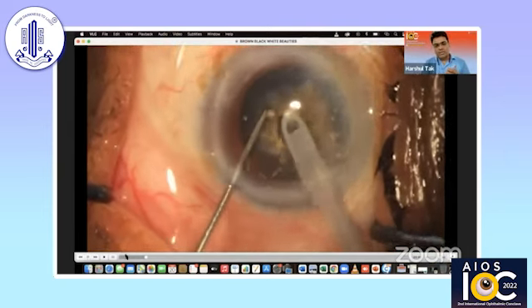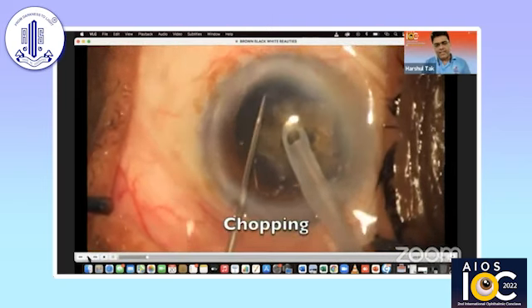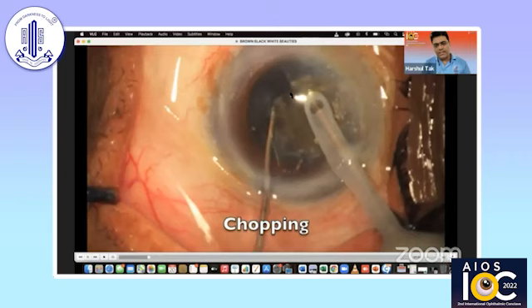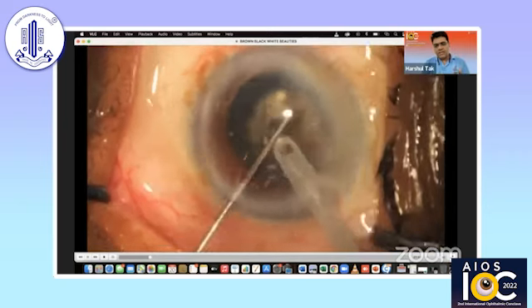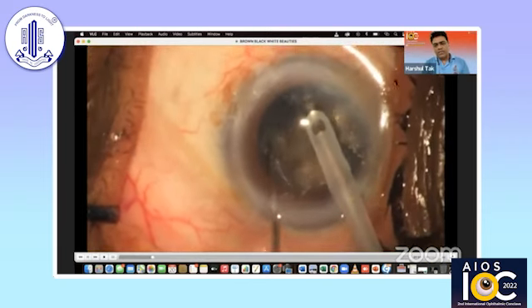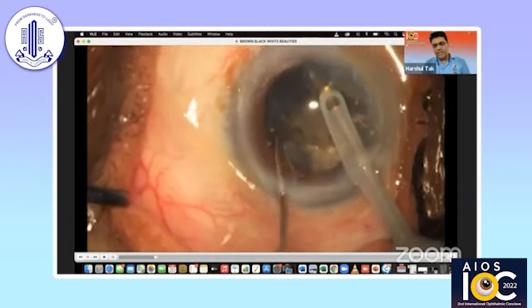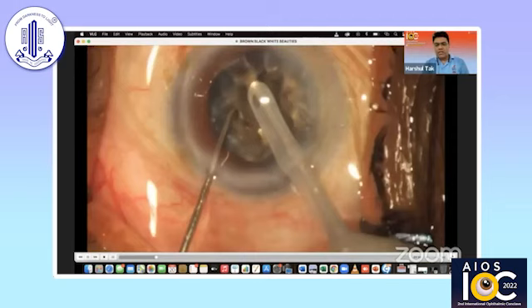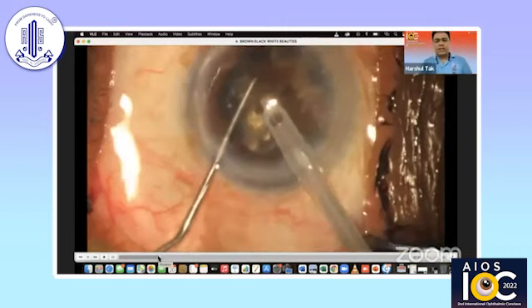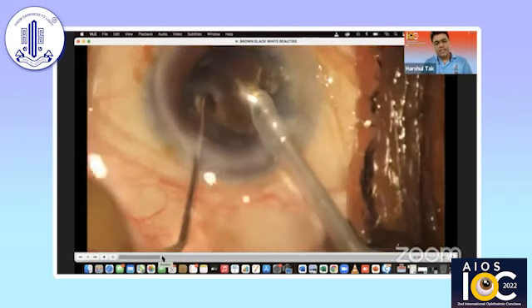I don't keep on rotating the nucleus; I keep drilling in the center. And once I've drilled enough in the center, I go ahead, hold it and give the first chop. As you can see, this first chop cracks the nucleus through and through, anterior to posteriorly. I rotate it 180 degrees, hold it and chop the nucleus again. Once you have these two pieces, I rotate it again 90 degrees and divide the nucleus into smaller pieces. In this way, you can easily crack the hardest nucleus using minimal phaco energy, utilizing the correct technique.